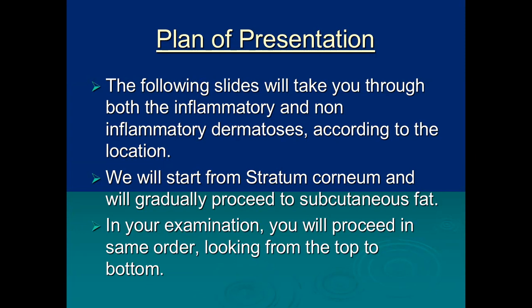The important or significant feature of this presentation is that I will be teaching you the tips of dermatopathology diagnosis during the examination while keeping the order intact, that is, from the top to bottom, whether you are viewing the histopathology slides on a microscope or in front of your computer screen.